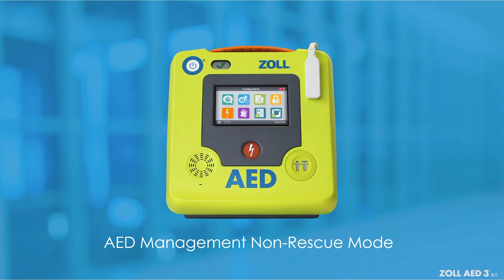Enabling Wi-Fi connectivity and other configuration settings will not be reviewed in this course. Please refer to the Zoll AED-3 Administrator's Guide to review how to adjust settings.